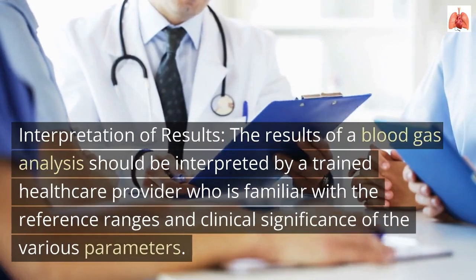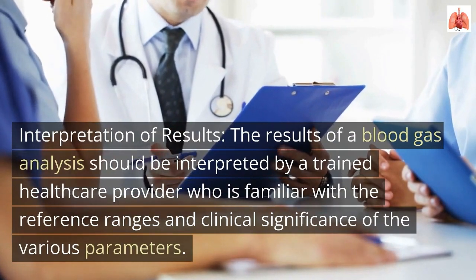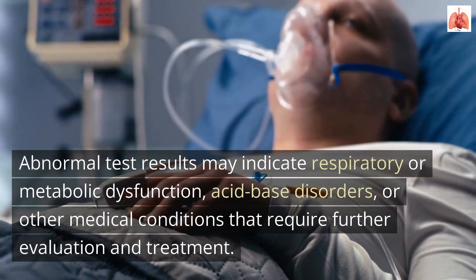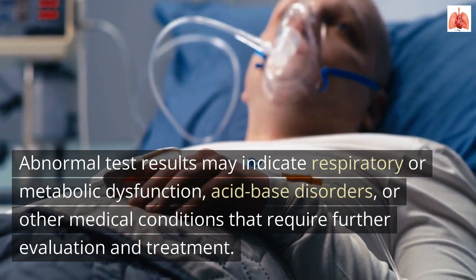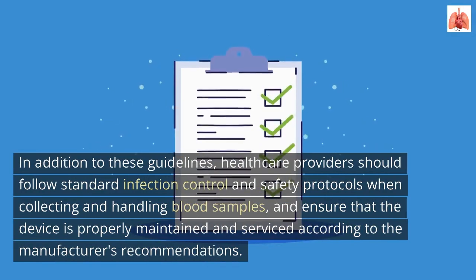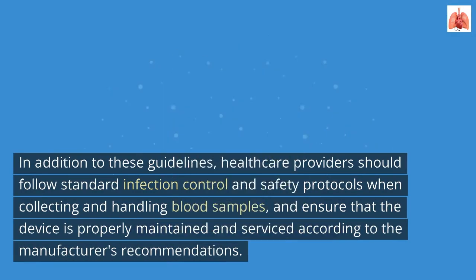Interpretation of results. The results of a blood gas analysis should be interpreted by a trained healthcare provider who is familiar with the reference ranges and clinical significance of the various parameters. Abnormal test results may indicate respiratory or metabolic dysfunction, acid-base disorders, or other medical conditions that require further evaluation and treatment. In addition to these guidelines, healthcare providers should follow standard infection control and safety protocols when collecting and handling blood samples, and ensure that the device is properly maintained and serviced according to the manufacturer's recommendations.